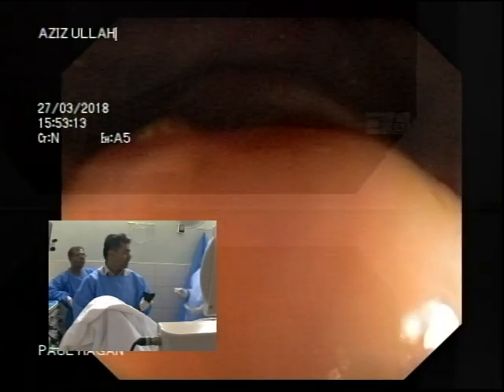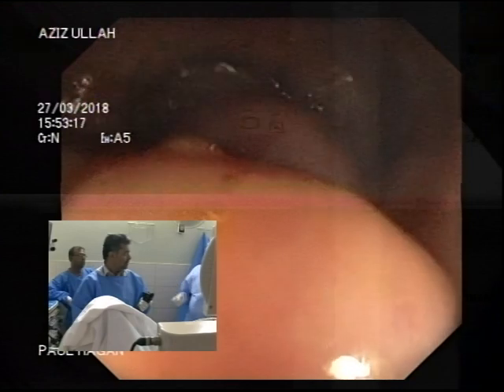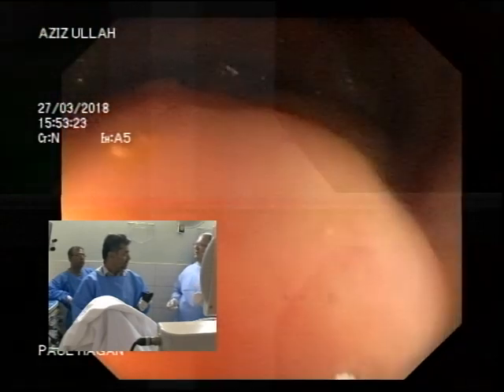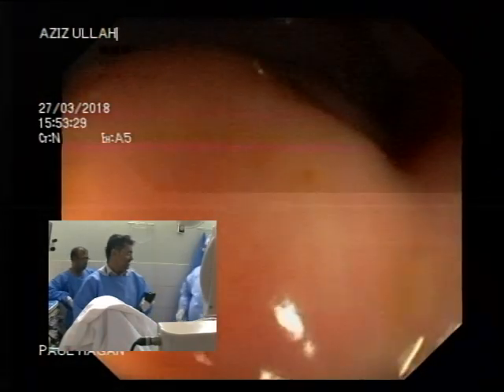It's a bit like playing tennis. A lot of people, when they play tennis, will hold another ball, or they'll have one in their pocket. When you serve, if you don't have the other ball, it feels wrong. It's like when I'm scoping, I like to hold a syringe. I like to feel the syringe in my hand, so I'll hold it between my fingers. It's just the way I do things.